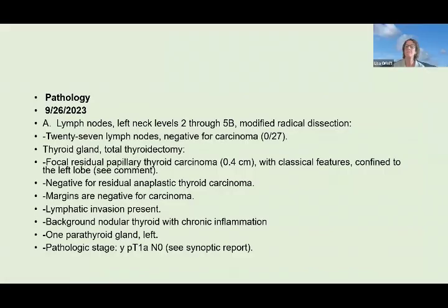Yeah, I'm like Joe. I'm always looking for it, but not hunting for it. I'm always watching for it. I don't go out of my way to identify it if it's not within the dissection of the superior pole. But I like the fact that if you do use nerve monitoring, it's not just recurrent laryngeal nerve monitoring, it is superior laryngeal nerve monitoring as well. Although you can visually see the cricothyroid muscle contract or feel it. So even if you're not using nerve monitoring, I think you can more easily assess the function of the superior than you can the recurrent. You can stimulate the recurrent laryngeal nerve without nerve monitoring too by palpating the posterior cricoarytenoid, but that's not visible.